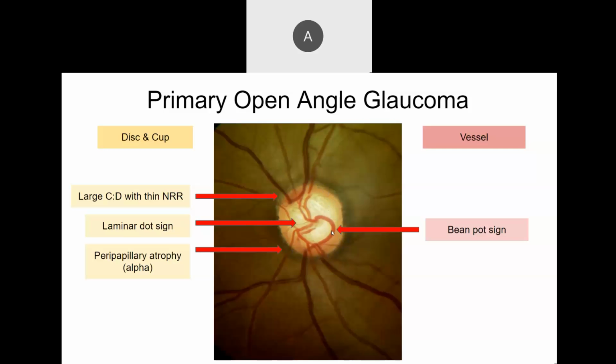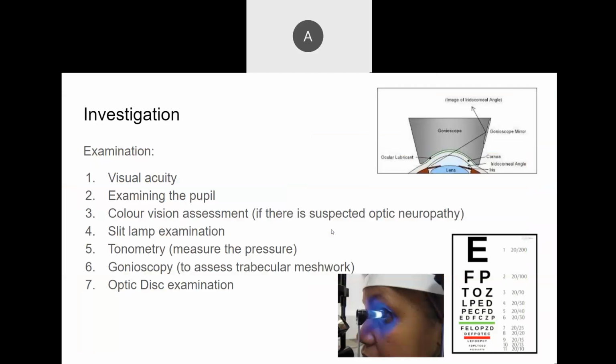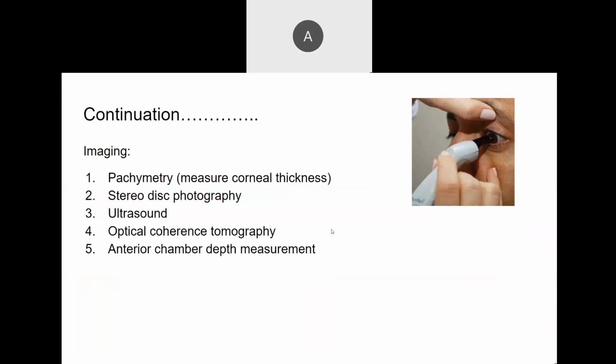Okay, good. So the normal cup disc ratio is? 0.4, 0.3 kan doktor? Okay, and this case berapa cup disc ratio? Nampak macam 0.8 or to 0.9. Okay, very good. Okay, alright. So future, I think the next presenter onwards, I just nak gambar this signs and then you go back to your investigation slide. Okay, investigation.